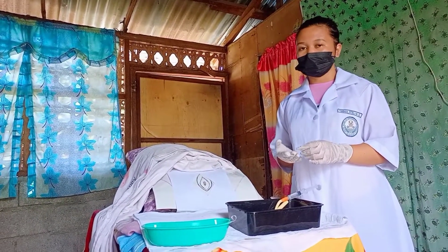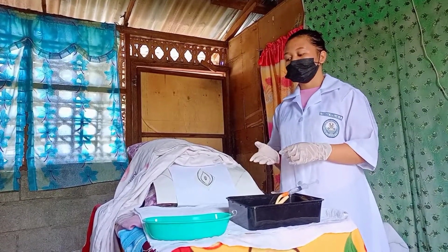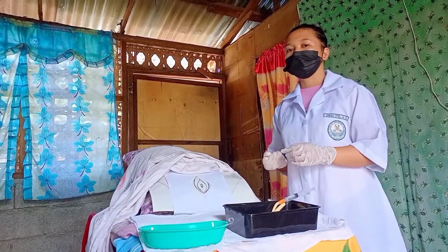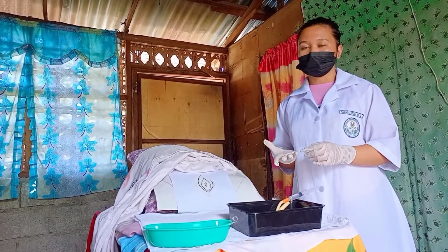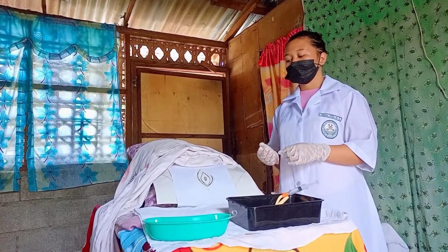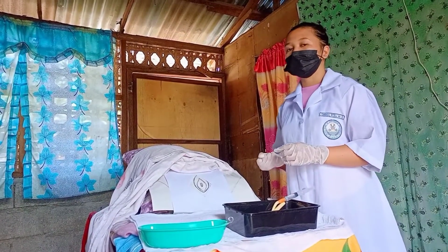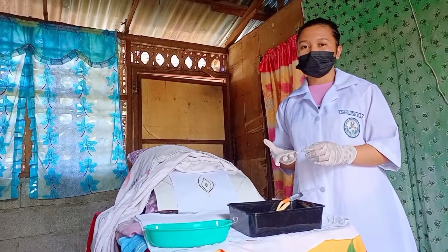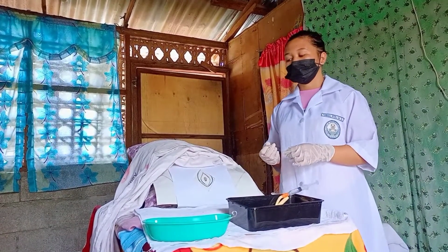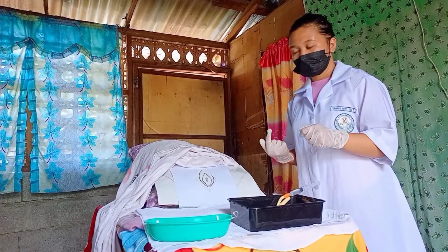For women, ask the client to bear down as though she is trying to void. Slowly insert the end of the catheter into the meatus. Have the client keep slow, deep breathing until the initial discomfort has passed. Insert the catheter gently about 5 to 7.5 cm, 2 to 3 inches, or until urine flows. For men, insert the catheter to about 17 to 22.5 cm, 7 to 9 inches, or until urine flows.